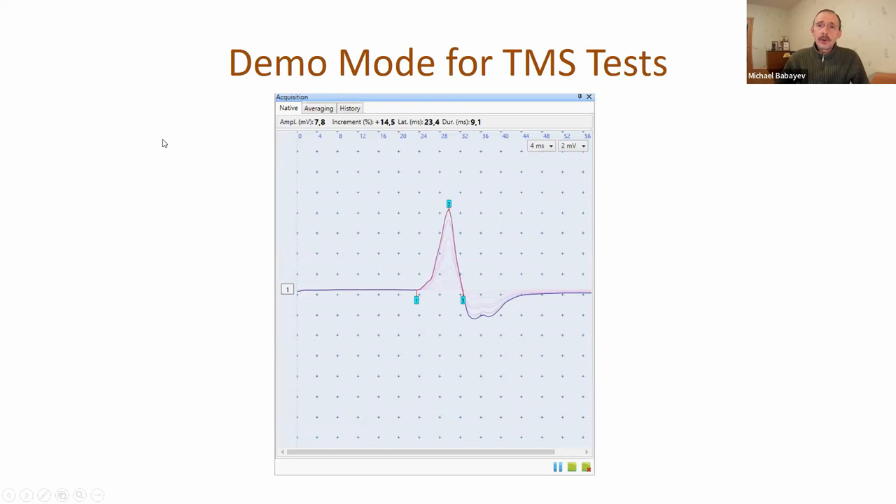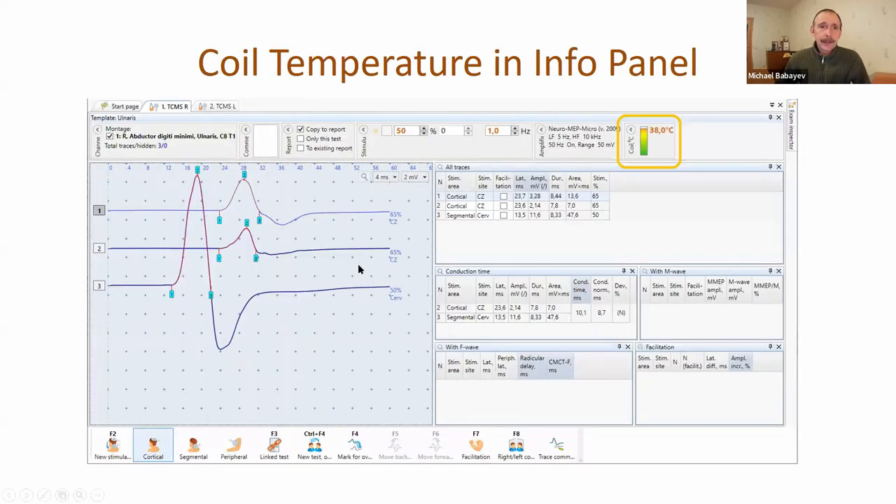We added demo mode for the transcranial magnetic stimulation test, because now it is a very popular technique and a lot of doctors are making paired stimulation, threshold tracking, and so on. Now it's possible to perform threshold tracking and paired stimulation in demo mode. We also added coil temperature to the information panel.